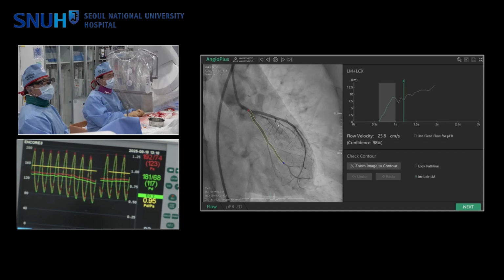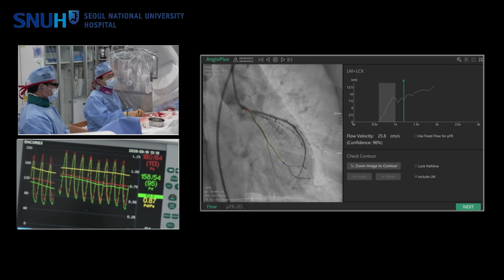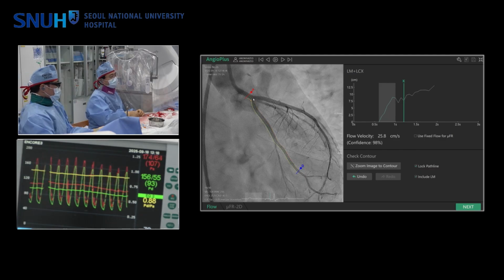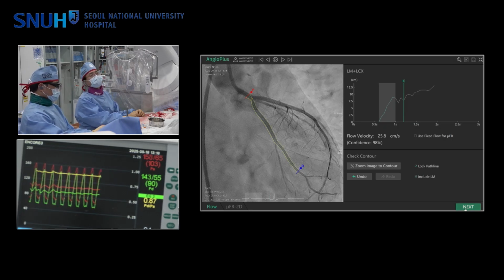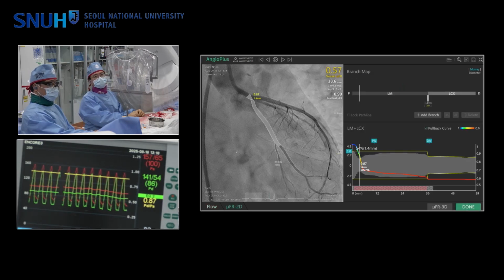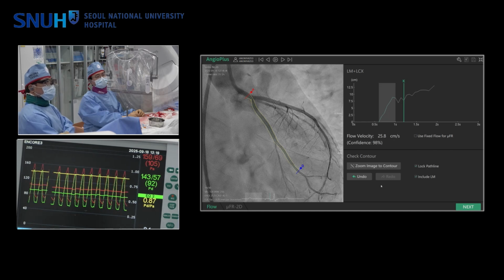Sorry. 뭐가 소리야? The FFR wire. 와이어가 좀 빠졌습니다. .88. 일단 오프하세요. 됐어. 그대로 놔둬. 레코딩. How about this? 87. 그전 디지트는 얼마였지? 지난번 8. Previous digit was 85 circ.